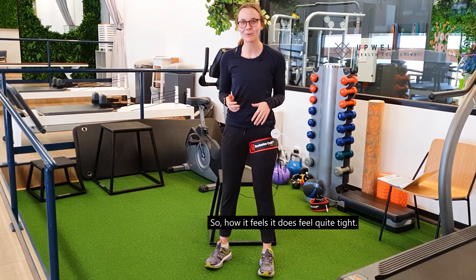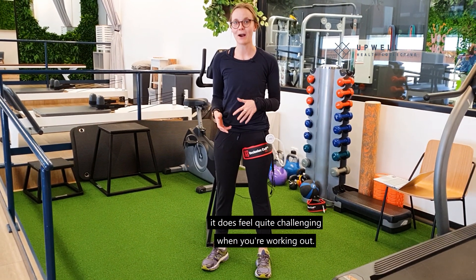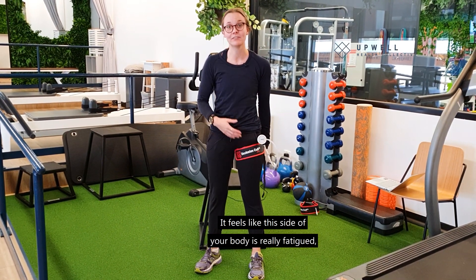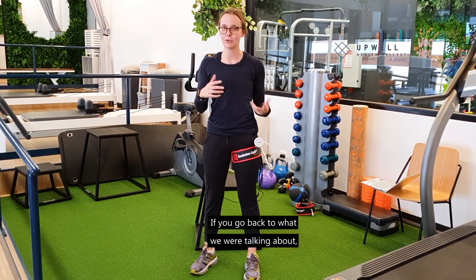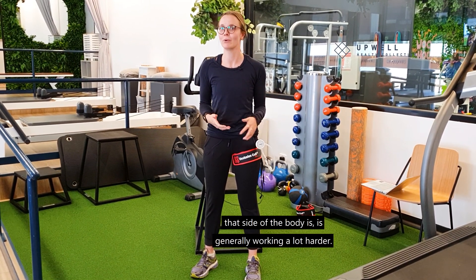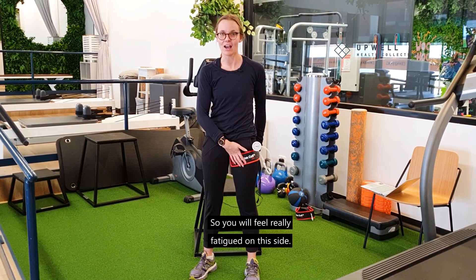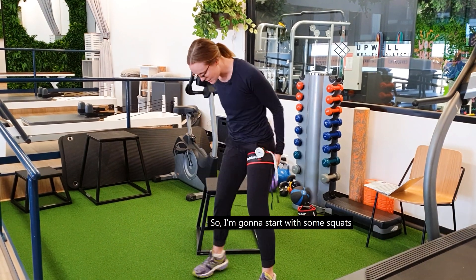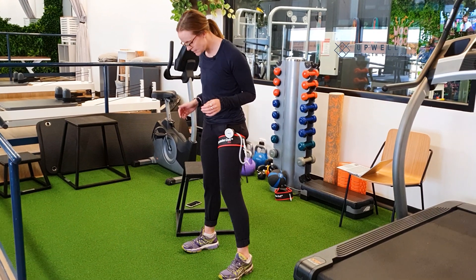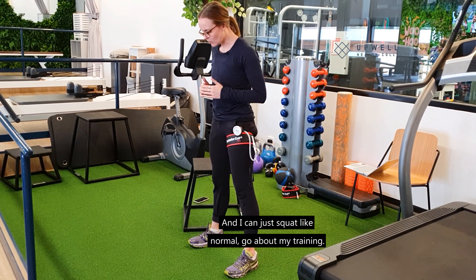In terms of how it feels, it does feel quite tight. A lot of my patients and myself find it feels quite challenging when you're working out — it feels like that side of your body is really fatigued, which is kind of what you want. Going back to what we talked about with the lactate accumulation and having less oxygen, that side of the body is generally working a lot harder. So you will feel really fatigued on this side. I'm going to start with some squats — my left side is going to be the one that's affected — and I can just squat like normal and go about my training.